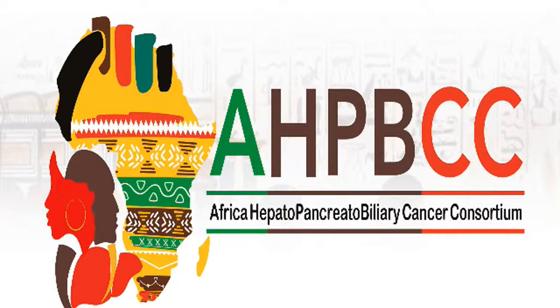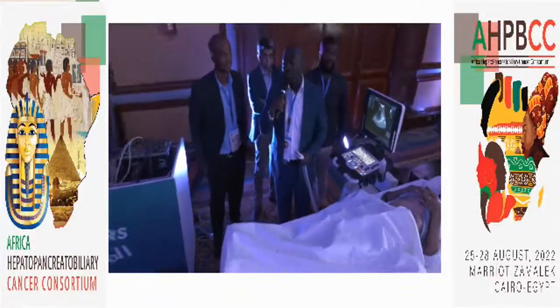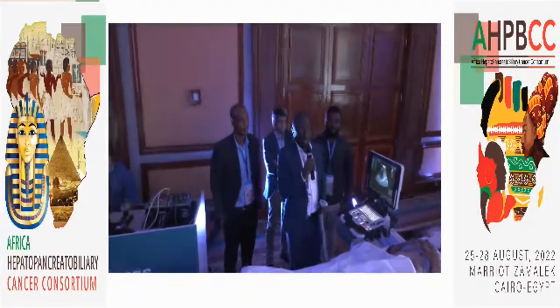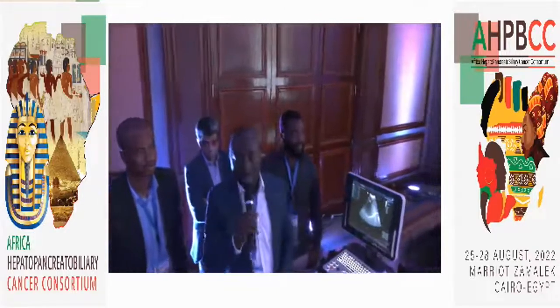But on average, up to 30 minutes could go a long way to evaluate the liver fully, even including evaluating Doppler pulse wave and appearances. But you need to take your time. It varies from patient to patient. Even if it takes you up to an hour, it is worth the time.